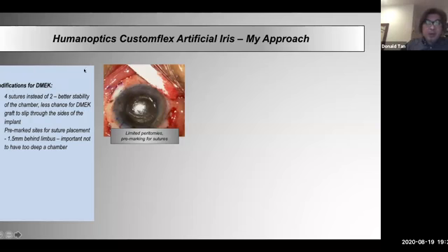I do everything here. I pre-mark first. And here's a really important point. Normally they would say you would put it around the pars plana, so about 2.5 millimeters behind the limbus. That's where your sutures will go in. Those are your incisions for your sutures. I place it a little bit more anteriorly. And so my favorite usually is 1.5 millimeters behind the limbus.